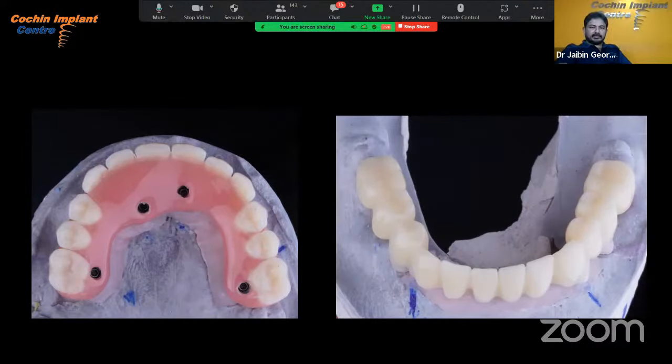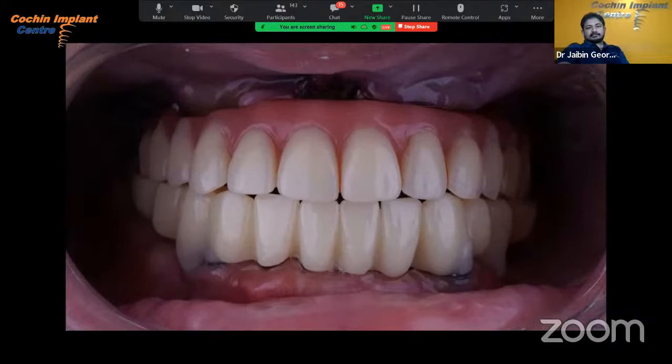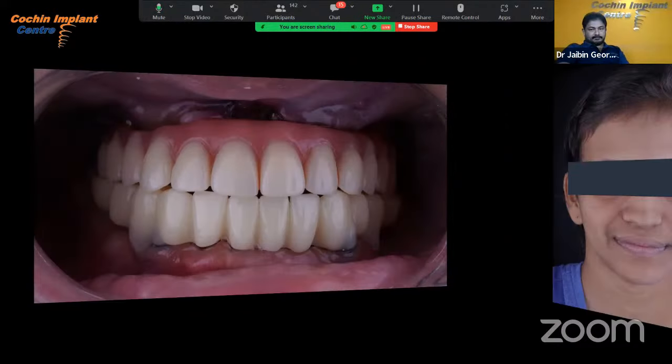Always we give screw retained prostheses. So this is a screw retained prosthesis on the multi units of the zygomatic implants. This is after 3 days, after fixing the prosthesis.